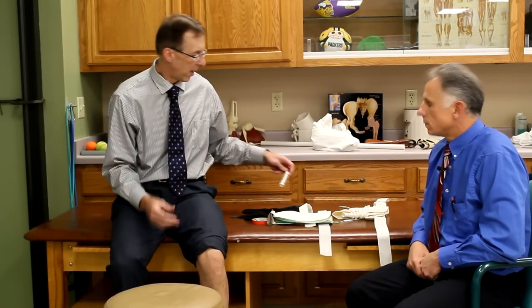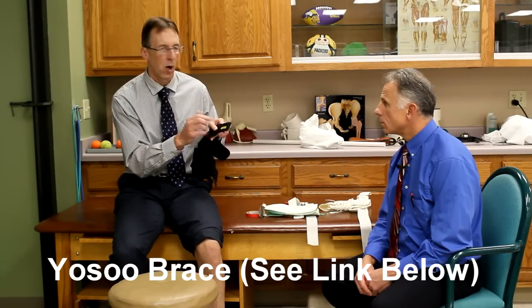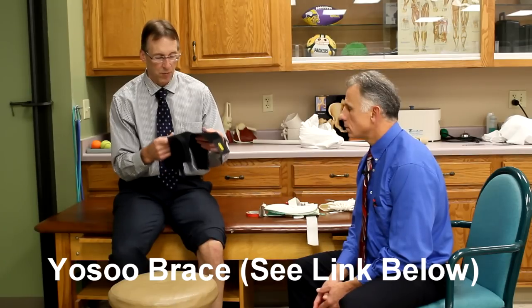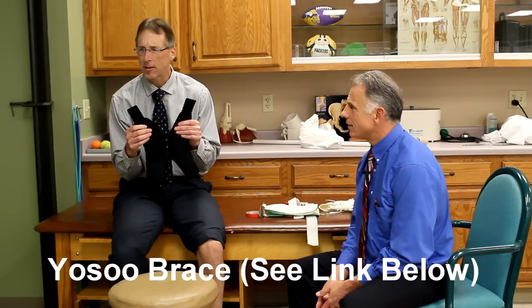If you have a grade one or grade two sprain and want to go back to sports — for a grade one, you could definitely use an elastic brace. These are neoprene braces that provide some nice support; some are like sleeves. This is a brace from Yoso — Y-O-S-O-O. It's a nice brace: it fits well, it's very adjustable, and it was only $9.45 on Amazon.